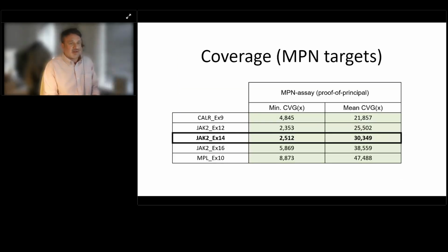Just a quick look at coverage, and this is something we're particularly impressed with. The chip that we're using allows us to return approximately 90 million reads. So if we put 96 samples on there, you're looking at almost 1 million reads per patient, and then you can divide that by the number of amplicons you've got, and you can see here the one we're really interested in was exon 14, where the V617 mutation is.